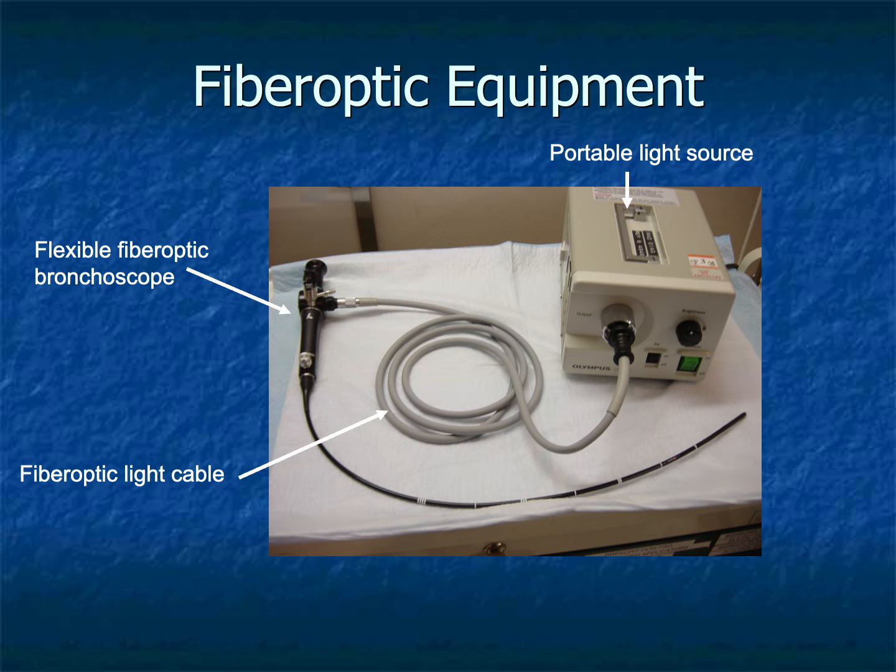Bronchoscopy began long before the bronchoscope enters the airway. It begins with the understanding of the instrument itself. The bronchoscope is not simply a device. It is an extension of the bronchoscopist's observation, judgment, and movement.